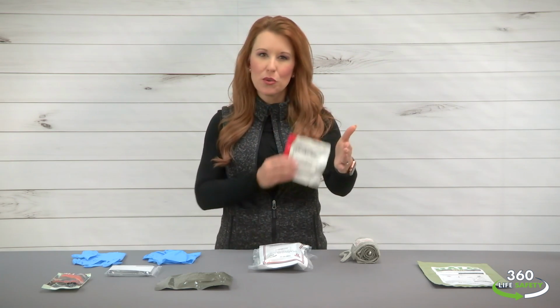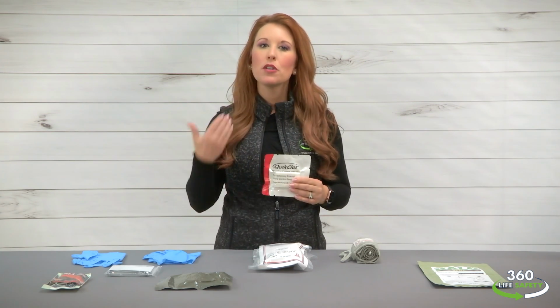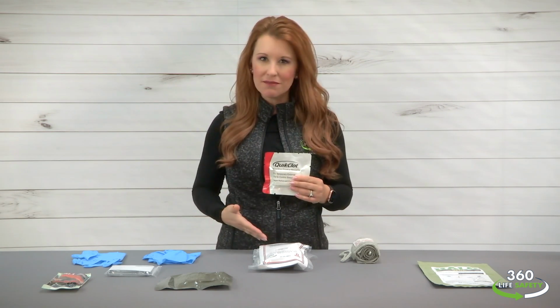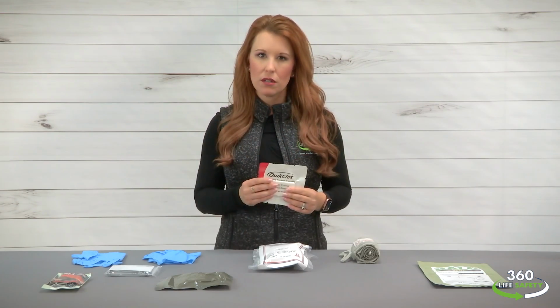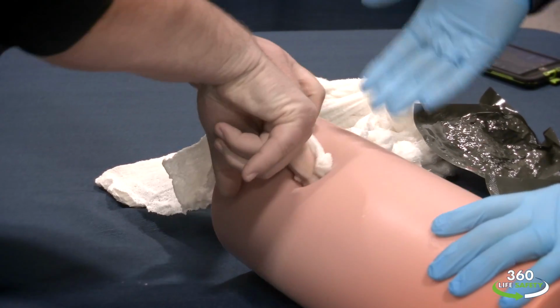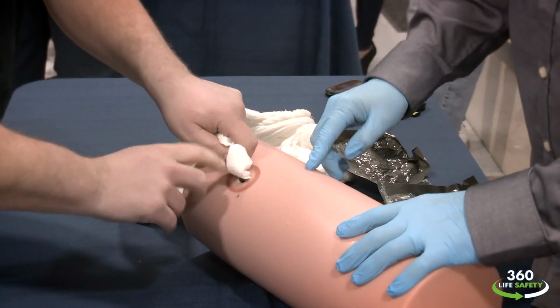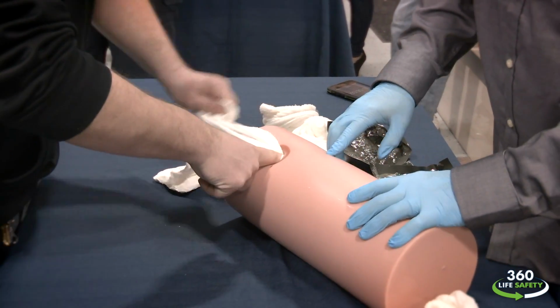Tourniquets are only used for limbs. So what if you have a deep laceration or a puncture to a shoulder joint or a groin or any torso junction? You want to pack it, and although you can pack it with gauze, what's great, like I said about this hemostatic gauze, is that it has that hemostatic agent to help clot the blood.